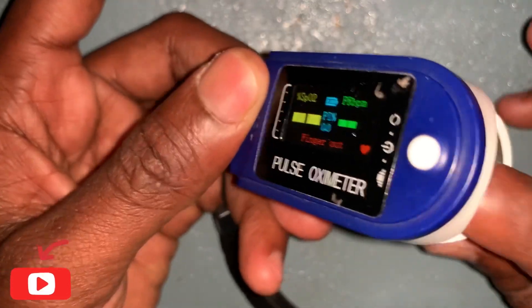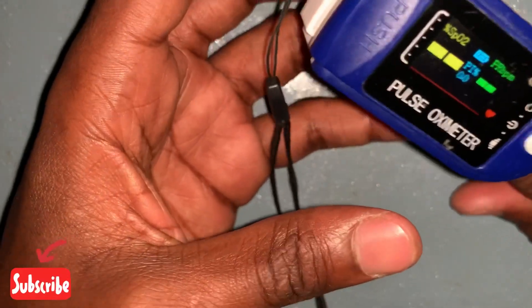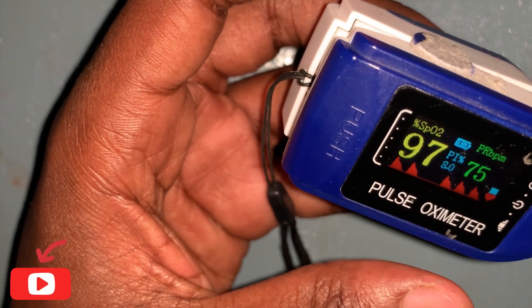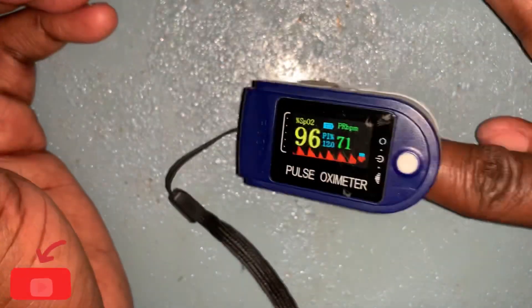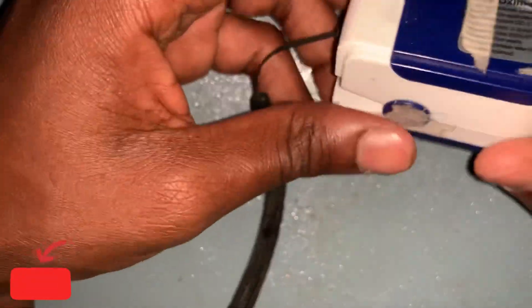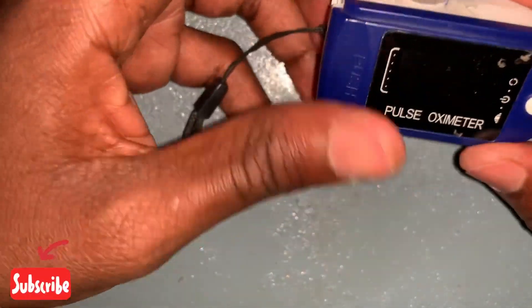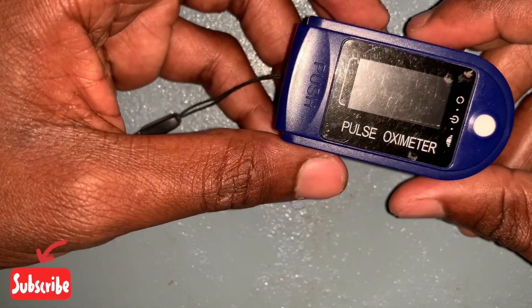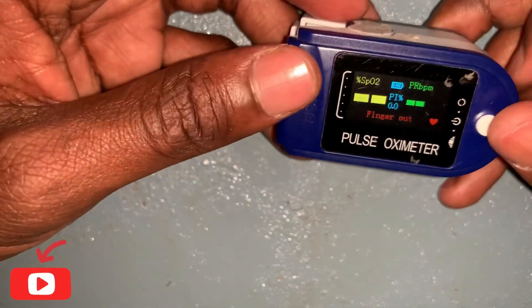This device you see here is a small but mighty device — it is used every day in hospitals. Let me put my finger inside. Thank you guys for watching Excellence Biomedical Engineering. If you enjoyed this video, please don't forget to support us by liking, commenting, and sharing.